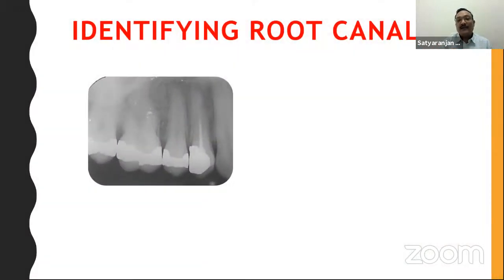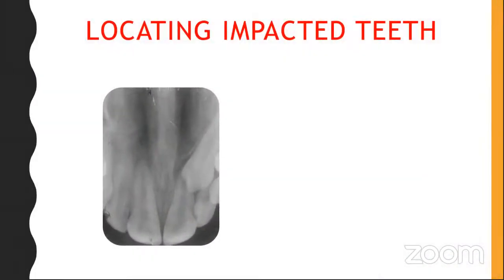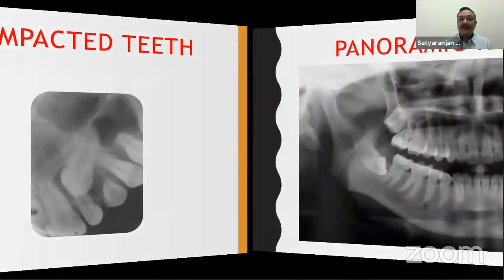Sometimes, as you see here, the root canal treatment has been done in the first premolar, and the lingual canal or the palatal canal is seen. So the buccal canal, if you want to see, you can see by taking another radiograph by shifting the tube on one side. A similar thing can be done with impacted teeth following the SLOB rule. So if you are shifting the tube, SLOB is same side lingual and the opposite side is buccal. So as the tube shifts horizontally, the impacted tooth or the foreign body or the object that you are trying to locate will also shift. If it shifts to the same side, it is lingual. If it shifts to the opposite side, it is buccal.